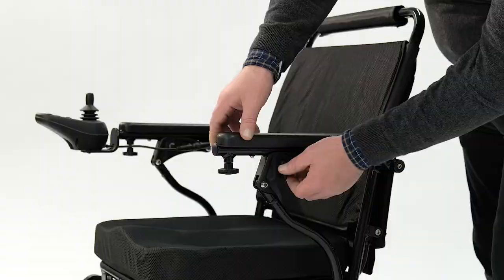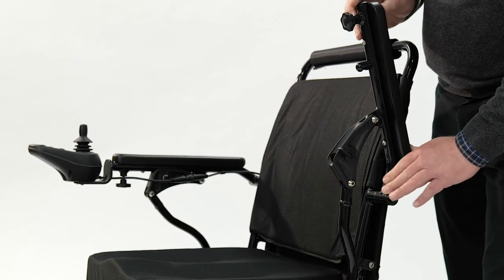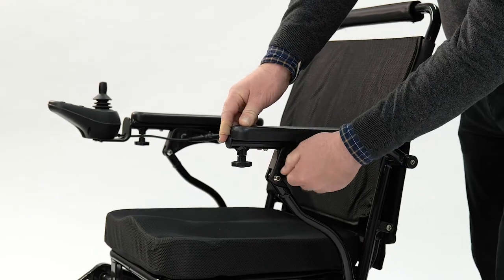Lift your armrest, turn the lever and lift up, then push back down and lock into place.